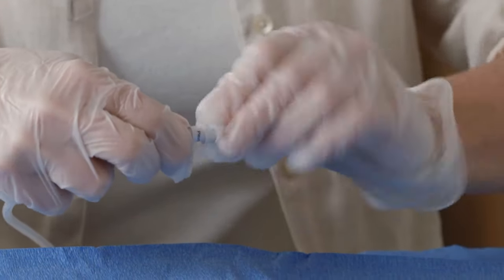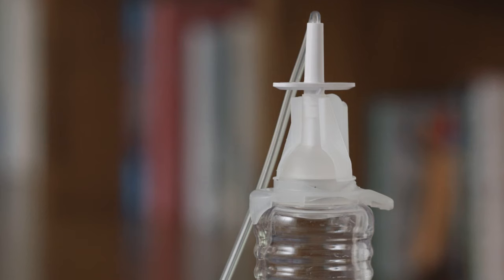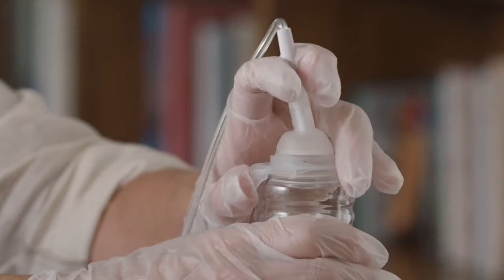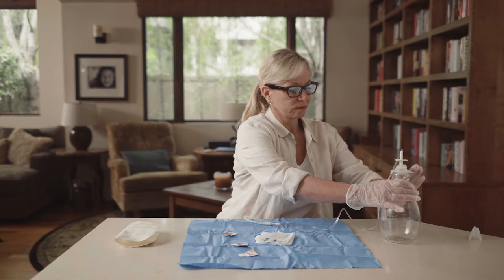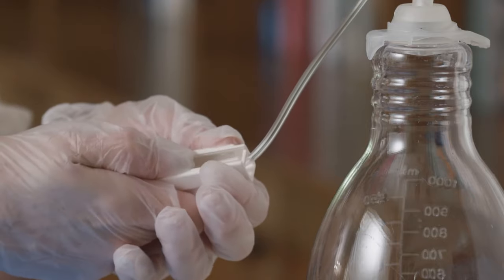Do not tug or pull on the drainage line. Plurex drainage bottles use active vacuum technology that provides suction to automatically drain the fluid. The support clip on the drainage bottle maintains the foil vacuum seal until you're ready to break it. To open the seal, steady the bottle with one hand and remove the support clip with the other hand. Hold and push the white T plunger straight down to puncture the foil seal. Remember that the white roller clamp on the drainage line is still closed. To begin draining, slowly open the roller clamp by rolling the wheel away from the bottle.